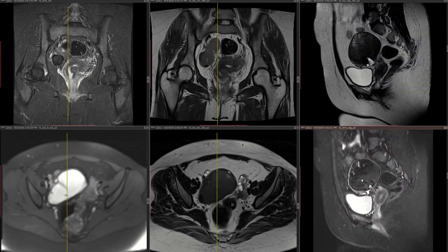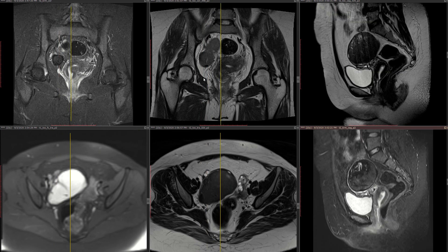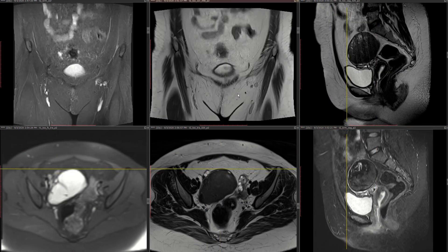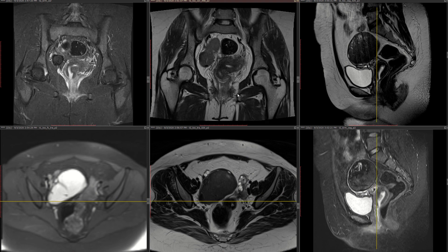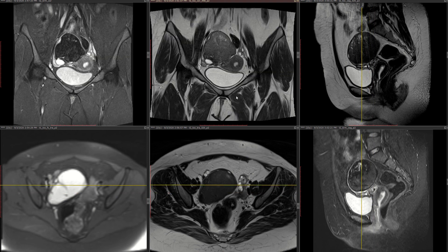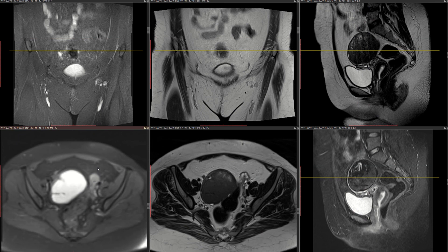My differential for this case is endometrioma. Please let me know in the comments if you have any other thoughts. Another differential I was considering is dermoid — which is T1 hyperintense — but it should have suppressed on T1 fat-sat. Some dermoids may not suppress depending on their composition, so dermoid is still a possibility, but it would not be this T2 hypointense. Thank you for your time.